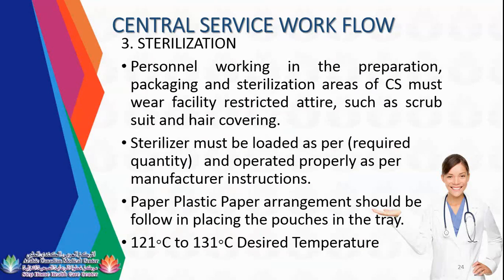Personnel working in the preparation, packaging, and sterilization area must wear facility-restricted attire such as a scrub suit and hair covering. Guys, this is very important. Once you enter any area of CSSD, even if you are not processing anything, you need to put on your scrub suit intended for CSSD and the intended shoes. So there should be dedicated shoes and a scrub suit for CSSD aside from the hair covering. So those are the three important PPE you need to wear.